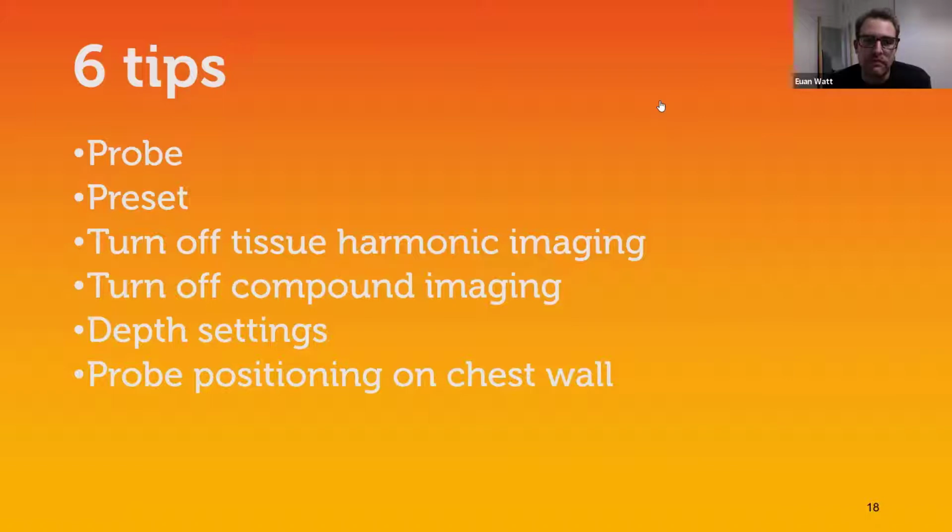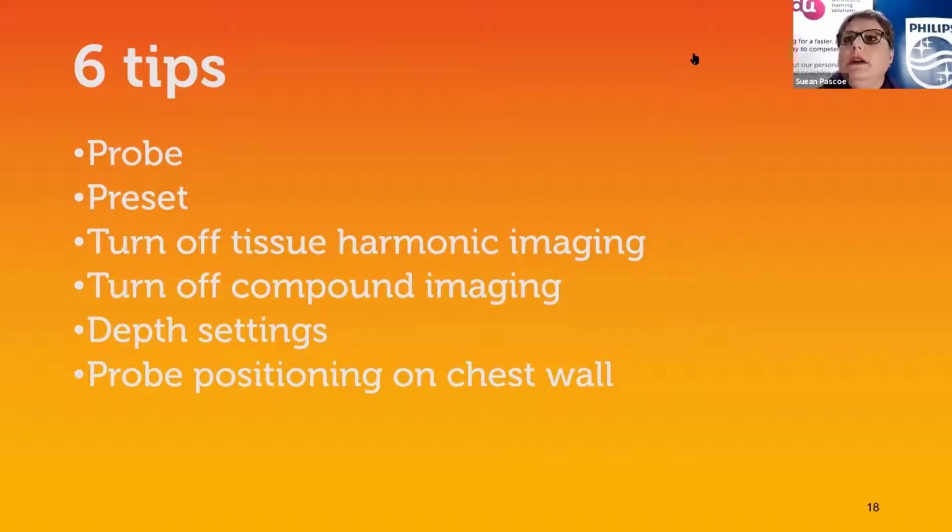The M mode is nice if you don't know how to save a loop. It's a nice way to demonstrate over time movement of one spot.